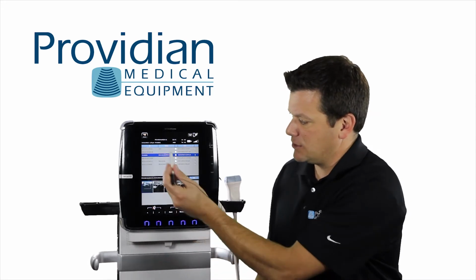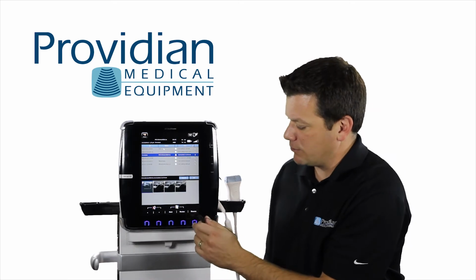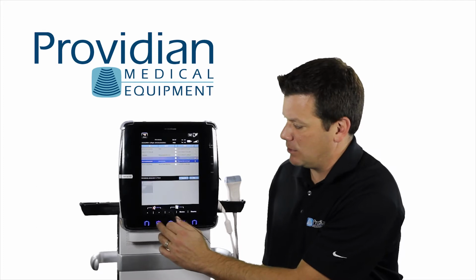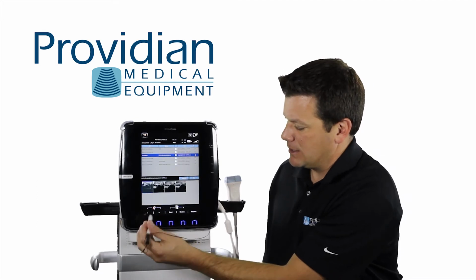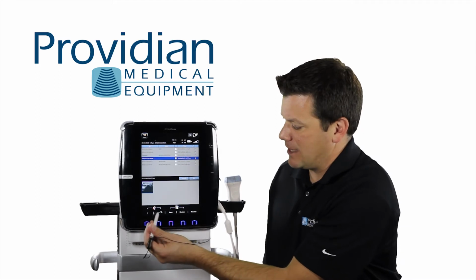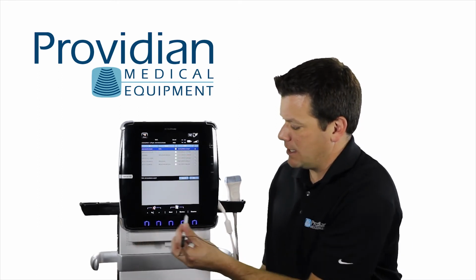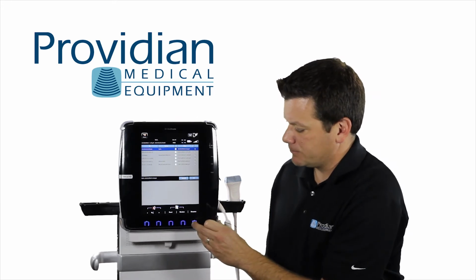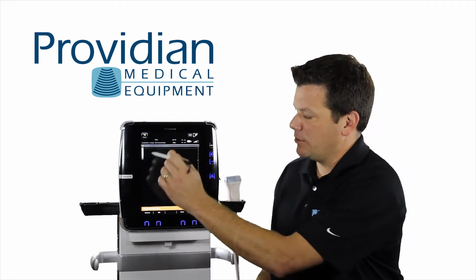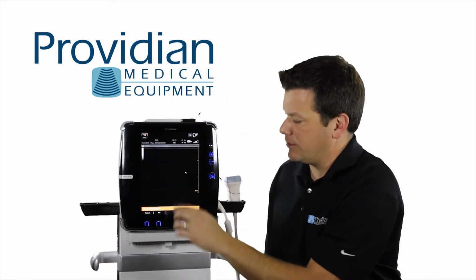I can use the search to search for a patient if this screen has more on it, or I can also resume this exam because I took it earlier today. Just selecting this here will let me sort through. As these are here, I can use this or this to sort through and find that previous exam. I'm going to go to the one I just created and I'm going to click resume.